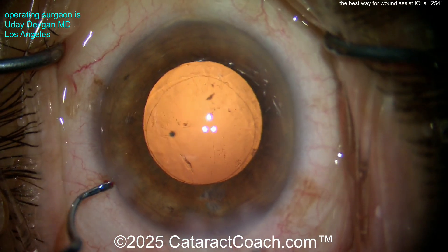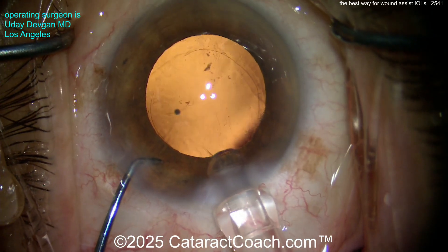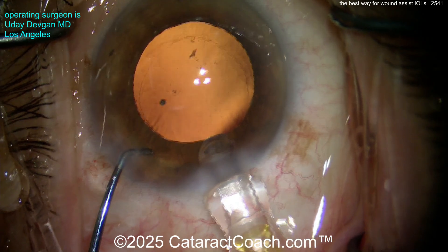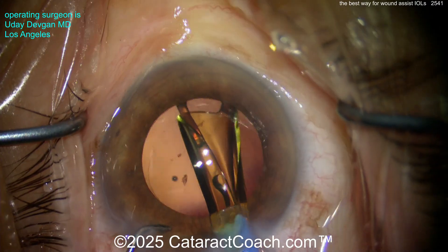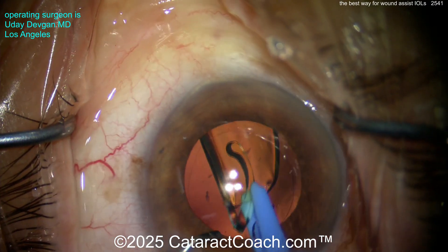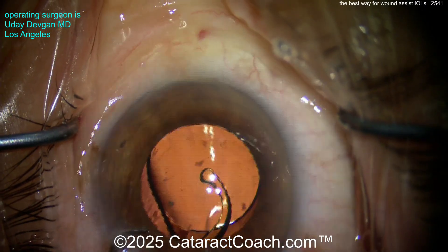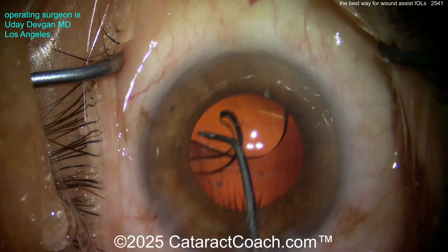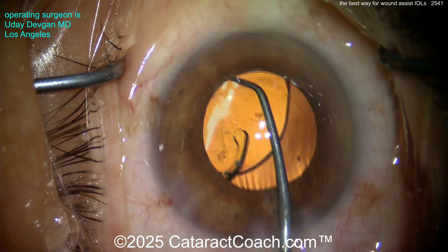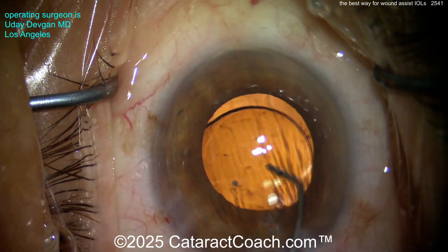Here's an easier one: the left hand is fixating the eye because the right hand is using a single-handed injector. This is a preloaded lens and a very easy one to deliver. If you have a preloaded lens with a single-handed injector — like a plunger type, or this trigger type with a CO2 cartridge for the Alcon lens — you can actually keep the eye in primary the whole time, because your non-dominant hand is fixating the eye.